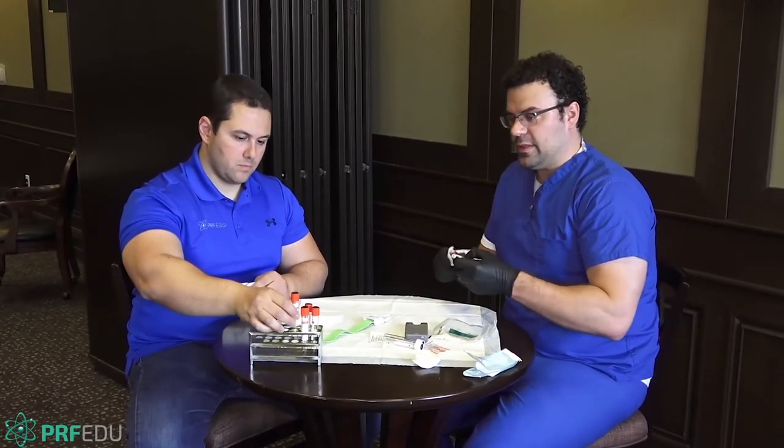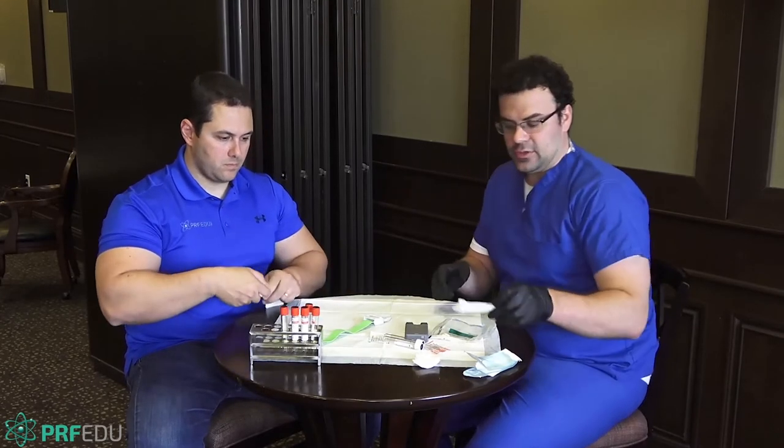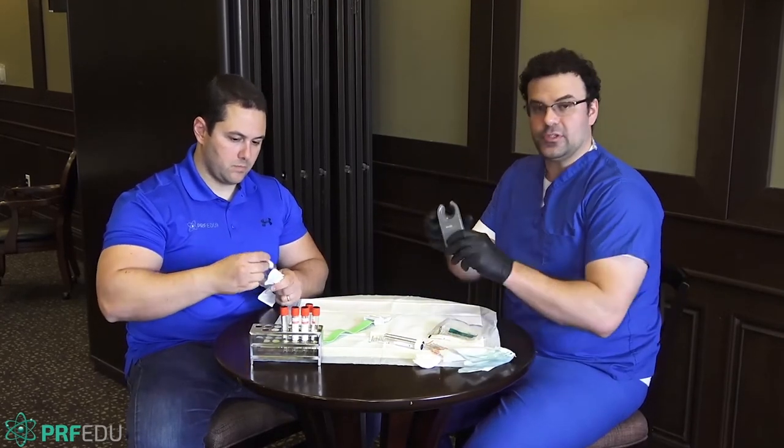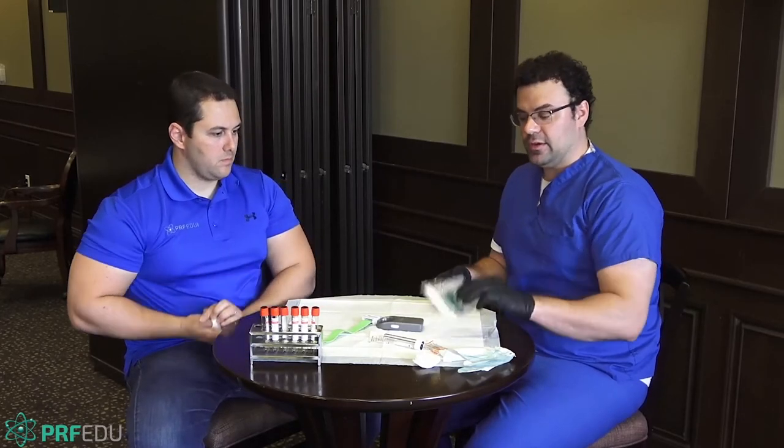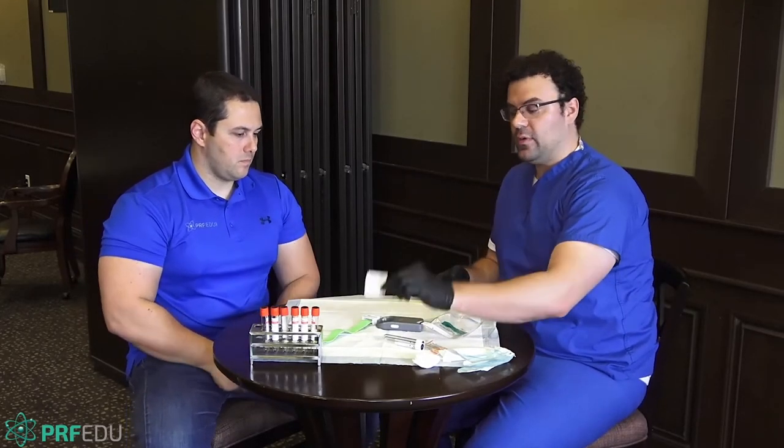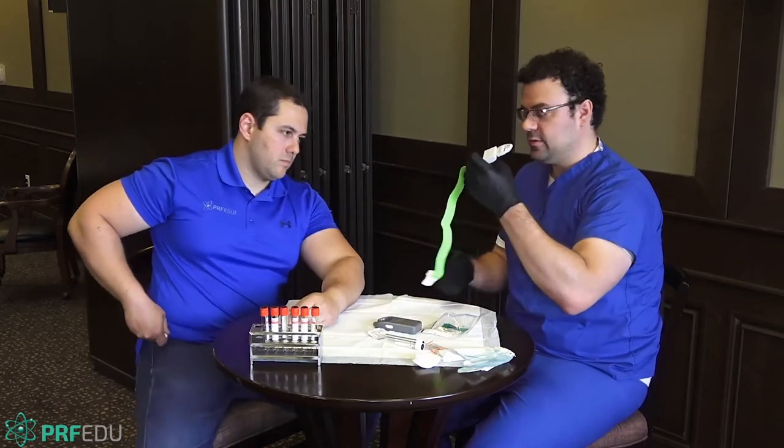So standard equipment that we have for phlebotomy is going to include a vein light, which we always use. It's very, very useful to find the veins. We have our butterfly needle here, we have our alcohol wipe pad, and of course we have the tourniquet, okay?